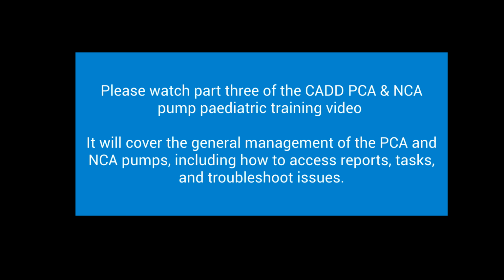Please watch part 3 of the CADD PCA NCA pump pediatric training video. This will cover the general management of a PCA and NCA pump while running on a patient, including how to access reports, tasks, and how to deal with troubleshooting issues.